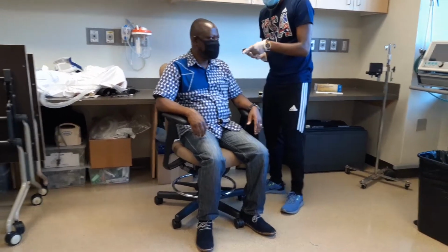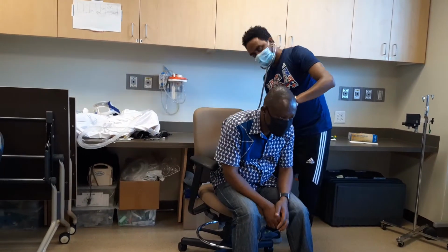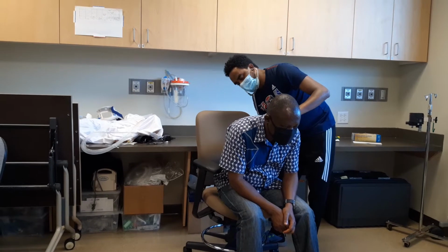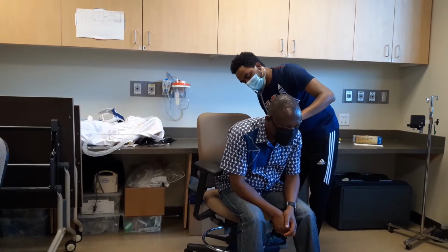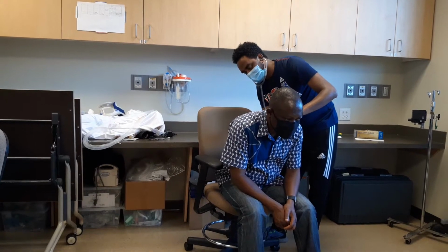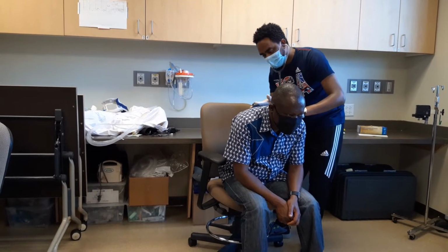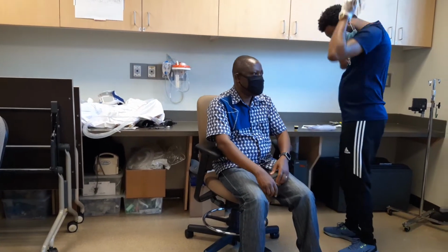All right. Can you lean forward for me? Deep breathe in. Deep breathe in. Deep breathe. All right, easy.